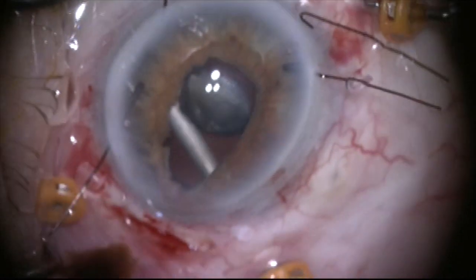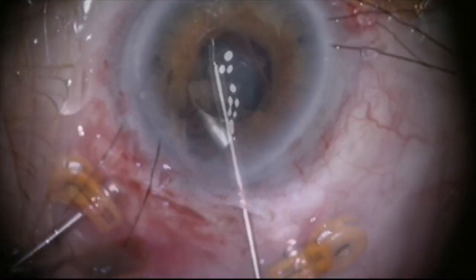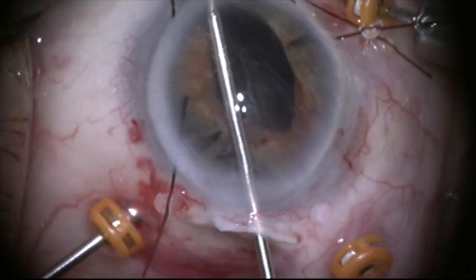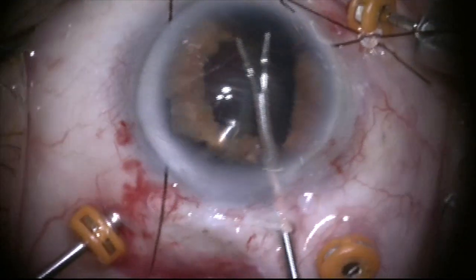So after one more attempt with the vitrector, I'm going to bring this up into the anterior segment where I think I can work with it a little bit better. I'll bring it up and park it back in the anterior chamber, and you can see how big this piece is — it's really almost the size of a lens nucleus, and it's very dark and very hard.